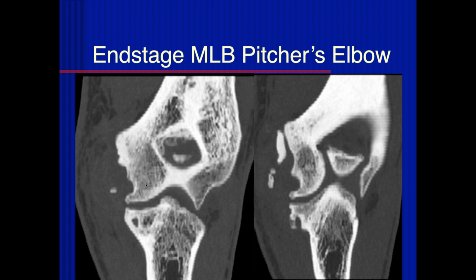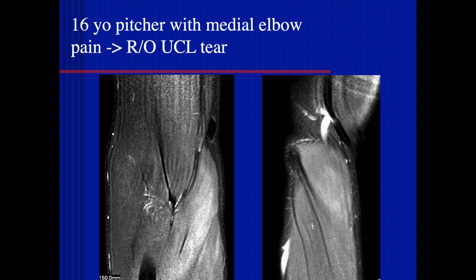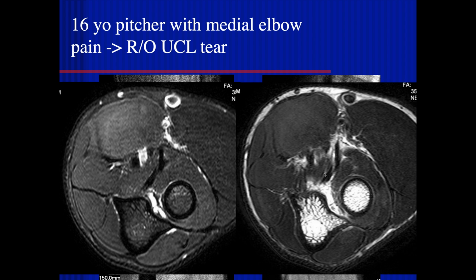So that's true. So see, Michael, what do you think of this case? Another medial elbow pain in a pitcher. Okay, so on that first image, or both images, we're seeing edema within the muscle. I guess kind of like in one of the common flexor muscles. I'm not sure which one. This would be the pronator.